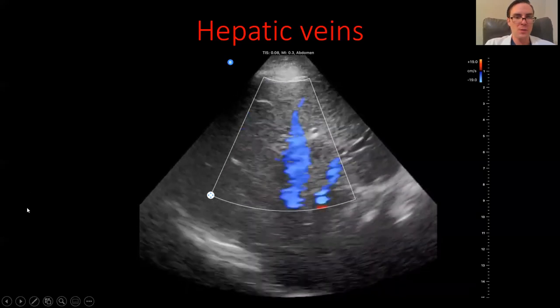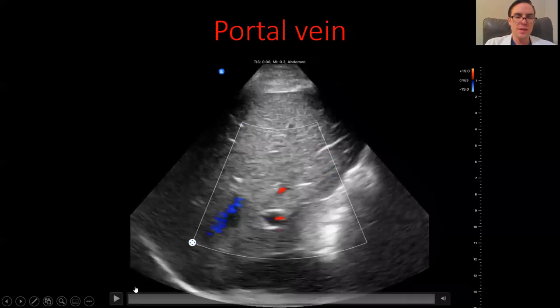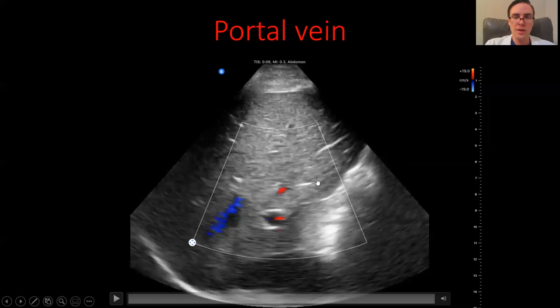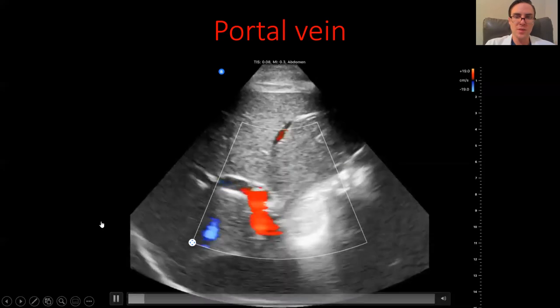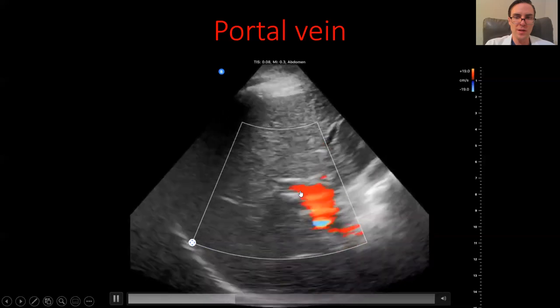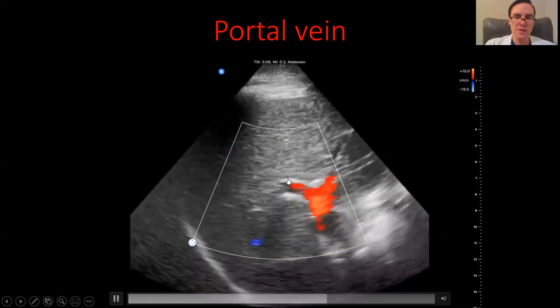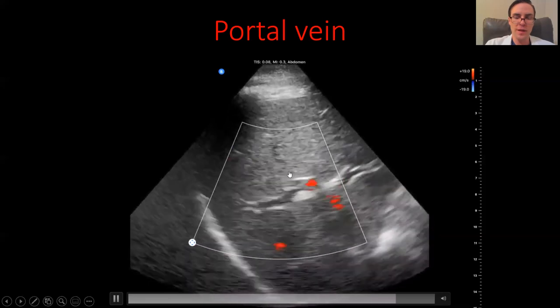The portal vein is quite different. It's actually traveling in the opposite direction from the hepatic veins, so it shows up as red on color Doppler because it's moving toward the transducer. The portal vein also has very thick walls — you can see these echogenic, whitish structures that form the thick wall. The wall needs to be thicker because the portal vein serves a different purpose: it's carrying a lot of nutrients at higher pressure, coming out of the intestines and bringing everything into the liver. That consistent red, high-volume flow through thick-walled vessels — that's the portal vein.